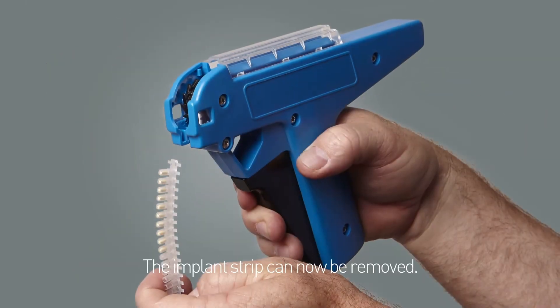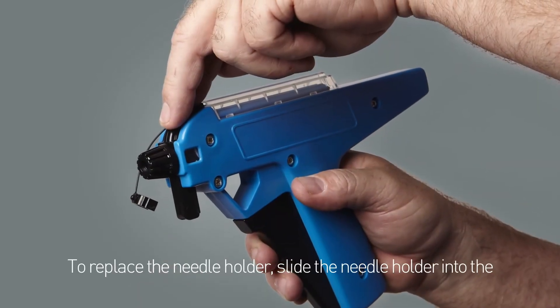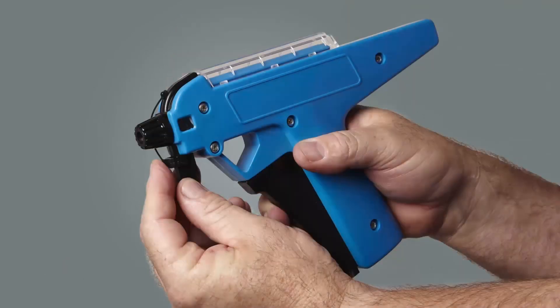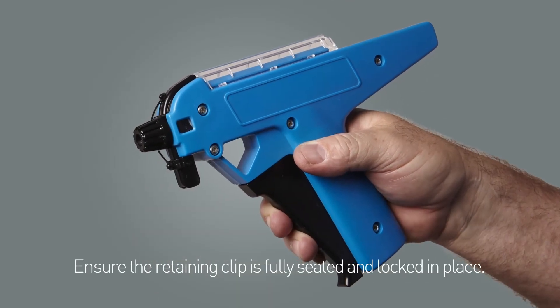The implant strip can now be removed. To replace the needle holder, slide the needle holder into the locating grooves in the implanter body and push down until fully seated. Replace the retaining clip and ensure it is fully seated and locked in place.